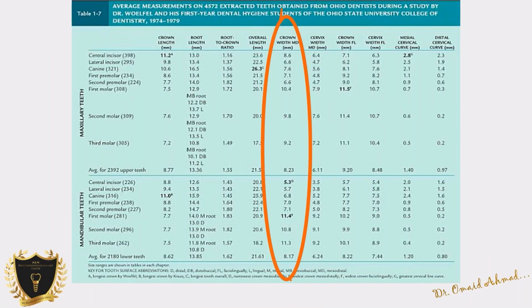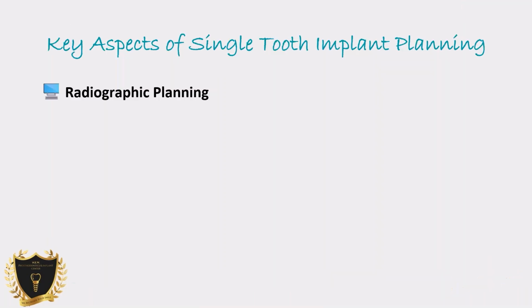And that gives an idea, because you don't want to get an implant at 7 millimeters. Now you're trying to restore something. There will be a mesial cantilever. You will not be able to do ideal proportions.